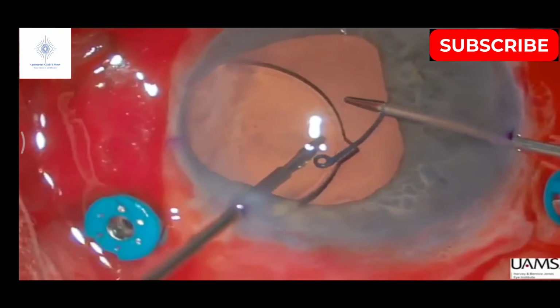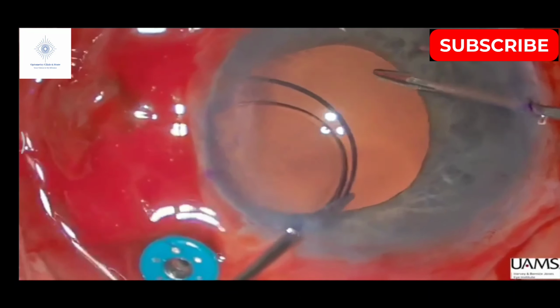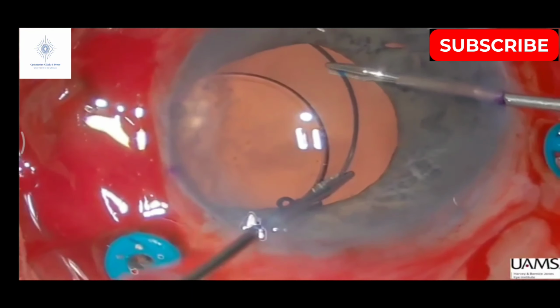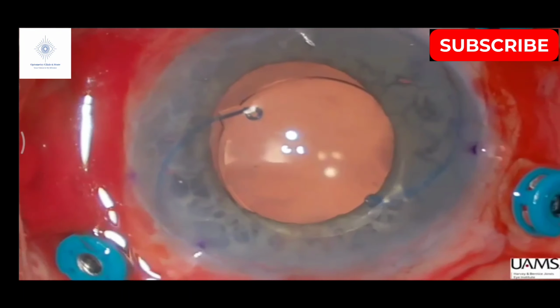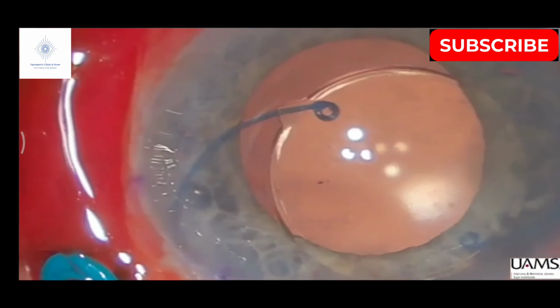Once the optic is moved enough to see the proximal haptic, the haptic is grabbed and withdrawn while the other forceps helps in stabilization. The lens is then centered in a stable position over the iris while the surgeon plans his or her next move. This may be scleral fixation of the same lens, lens exchange, or lens removal.